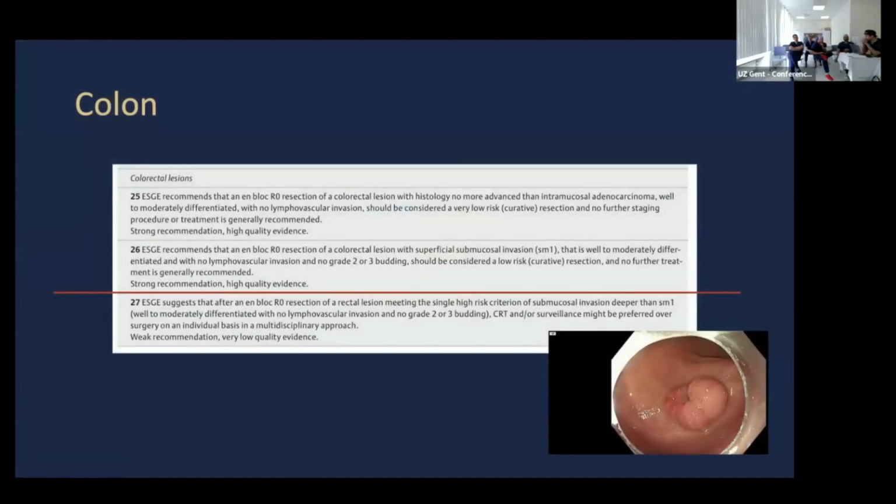So, indications for ESD. We're on a colon day, so we'll talk about the colon. Tomorrow we'll talk about the upper GI. In the image, I think you see the standard thing that you might want an ESD in, the rectum. Maybe it's even deeply invasive, and we could discuss the other potential things you could do.